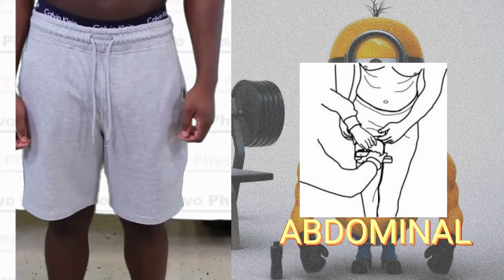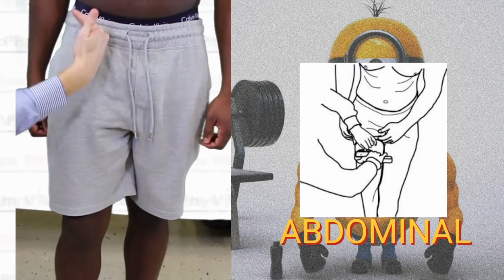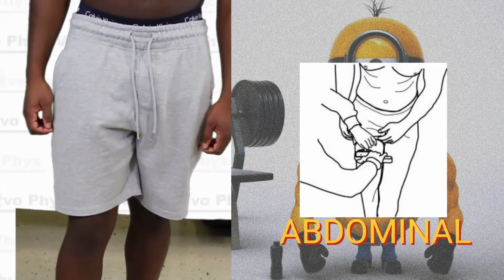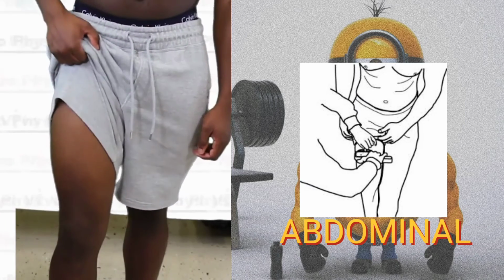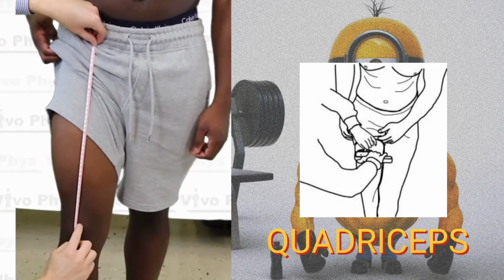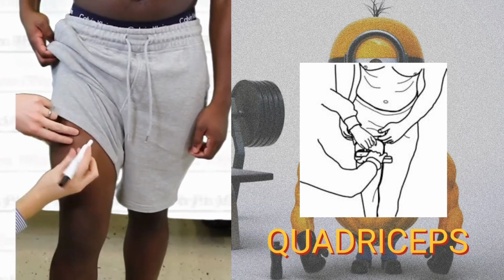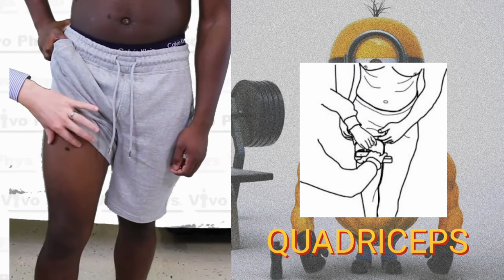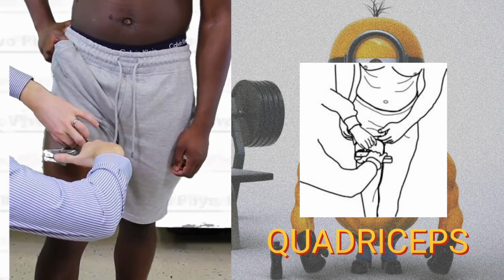The thigh skinfold is oftentimes the most difficult. The fat, the muscle, and the skin sort of intertwine sometimes there, but just do your best to separate them as much as you can and do the pinch. The thigh skinfold site is going to be halfway between the inguinal crease on the right leg and the patella on the right leg. The inguinal crease is the crease that your leg makes when you lift your knee up, so it's the crease between your torso and your upper thigh, essentially. Again, halfway between those two on the midline of the front of the right leg, and you're going to be doing a vertical skinfold here.